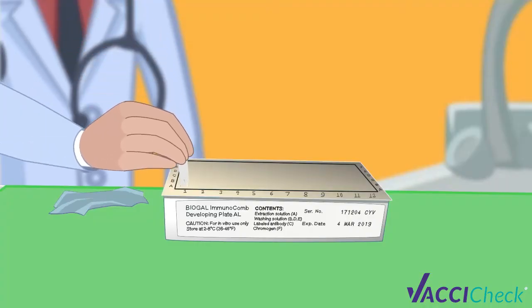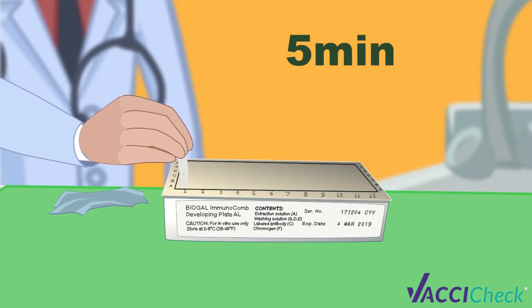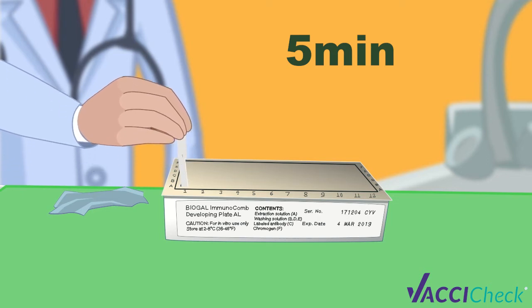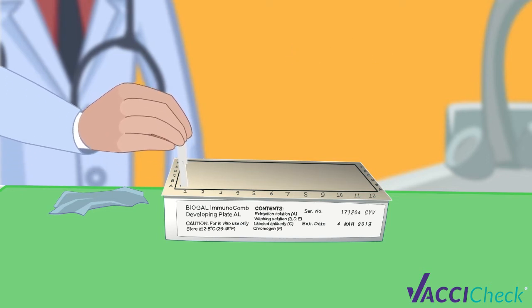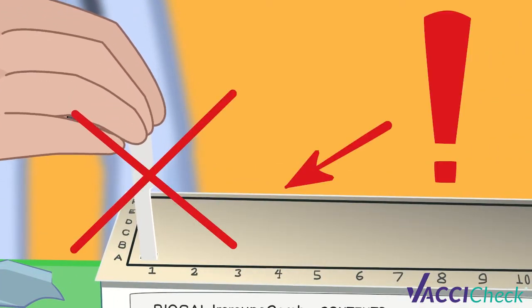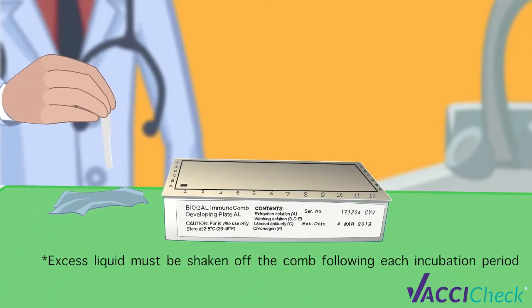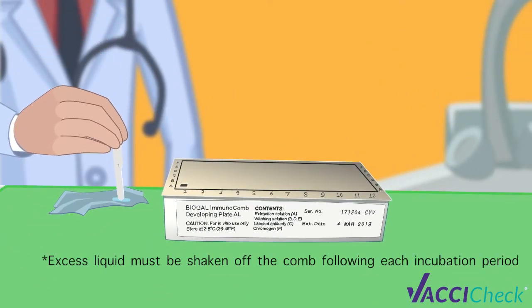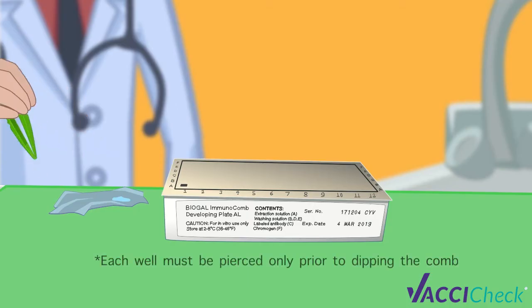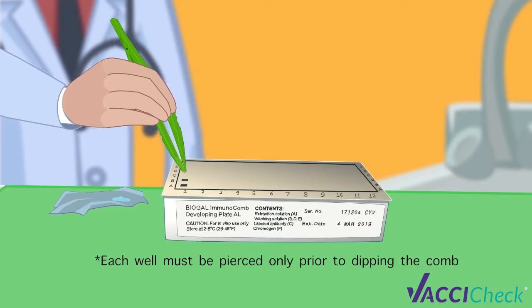For row A, insert the comb and incubate for 5 minutes. Mix by moving the comb up and down 3 to 4 times. During incubation, repeat the same mixing process 2 to 3 times. Avoid scratching the front active side of the comb by leaning it to the back while mixing. Gently shake off excess liquid from comb teeth onto a tissue before moving it to the next row. This applies for all preceding steps.